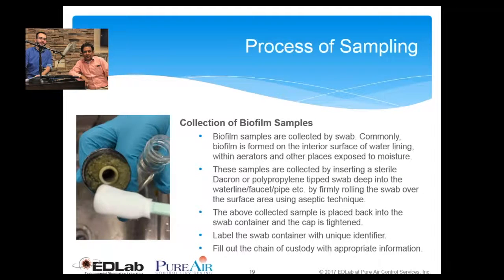Can you explain how to collect a biofilm sample? This is very interesting, Ronnie, because many a time biofilms form and go unnoticed, especially in a faucet and the faucet joints.